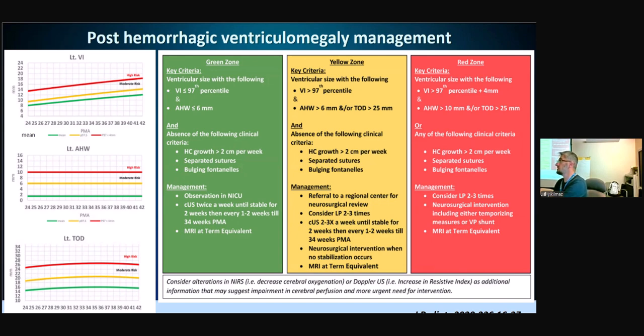It doesn't mean that you will change your morbidity or prognostication. Or if it becomes grade 4, you won't change your grading. It's based on the first ultrasound. So on the follow-up ultrasounds, it doesn't make much sense to regrade.